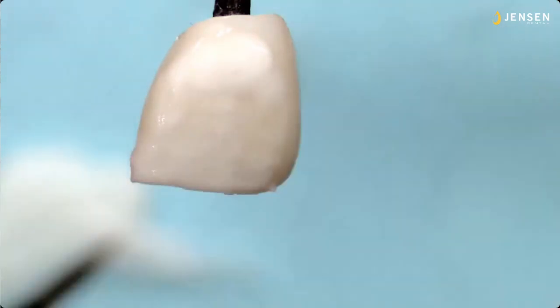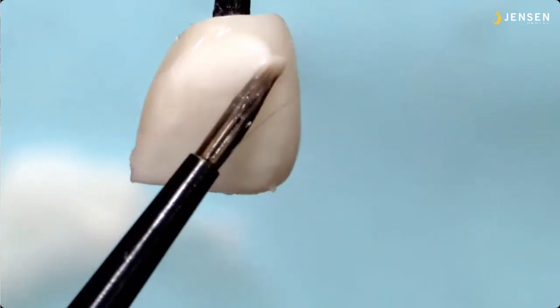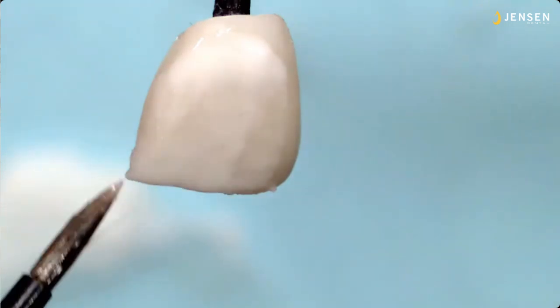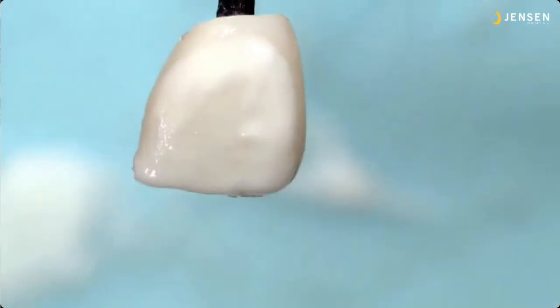Okay, so now I've got a looser mix, and I can add some on top. It's just like adding porcelain now. Another thing I want to caution you about, and this is besides the dimension, and that is make darn sure that your material is clean. You don't want air bubbles and you don't want dirt.